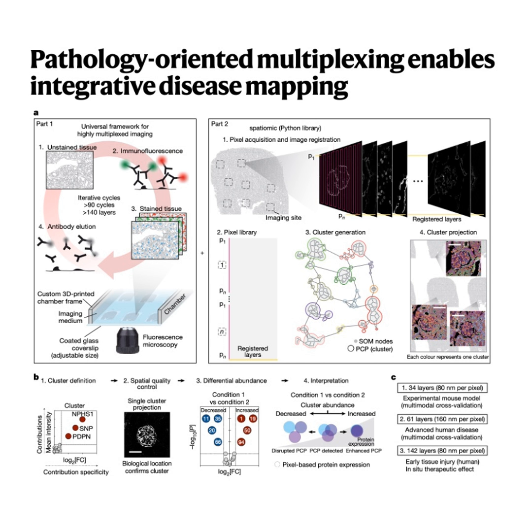It absolutely could. Even though the tissue looked normal by standard criteria, PathoPlex revealed subtle but significant changes. It found a decrease in clusters associated with healthy proximal tubule structures, things like the integrity of the brush border, mitochondrial health markers, and lactate transport proteins. So signs of early vulnerability or dysfunction in those key cells. Exactly. And conversely, it saw an increase in other clusters, like ones representing stromal cell filopodia, tiny cellular extensions potentially involved in early tissue remodeling, and changes in vascular smooth muscle cells. These are whispers of pathology at the subcellular level. The disease is simmering below the surface, visible only at this resolution.